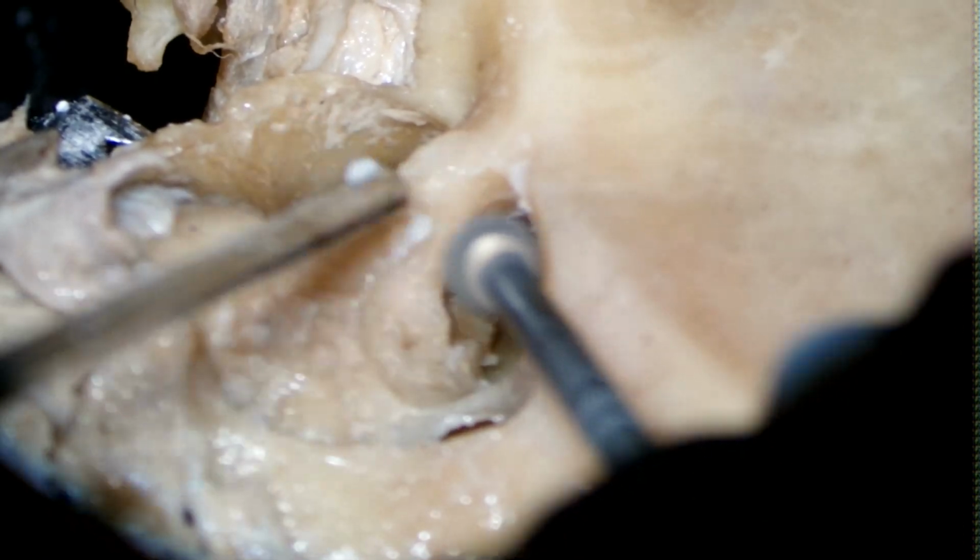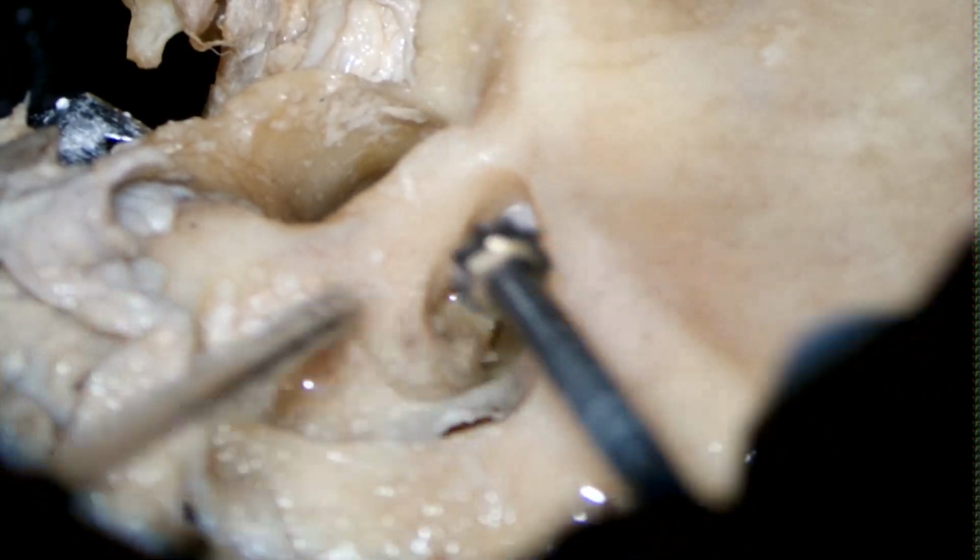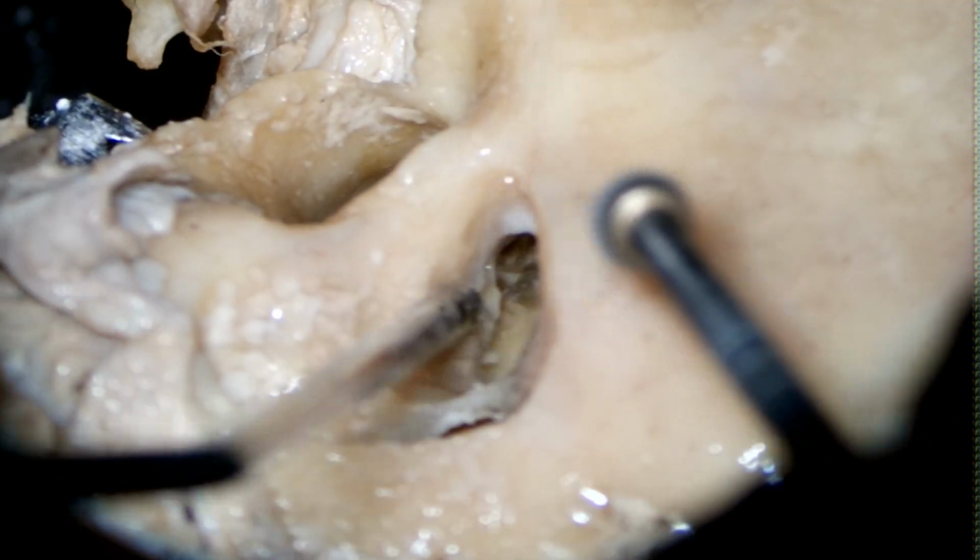Right. So when we are doing a posterior tympanotomy, it is important to thin the posterior canal wall, and it should be almost like a papery thin wall.